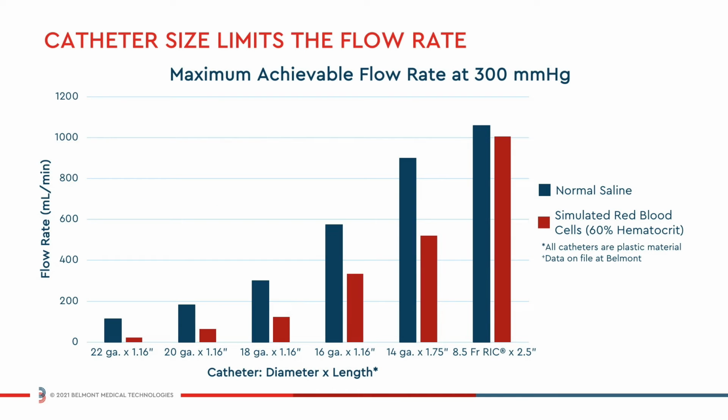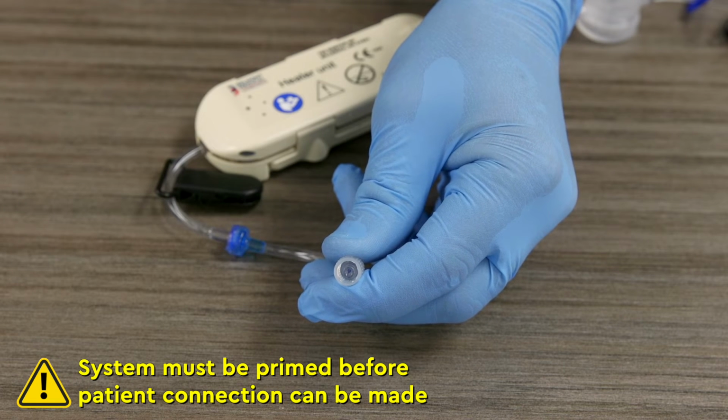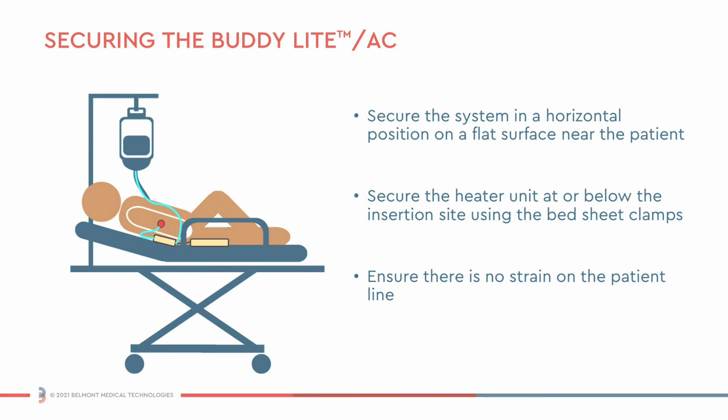To begin operation, first select the appropriate catheter size for the intended flow rate. Using aseptic technique, disconnect the red luer cap and connect the Buddy disposable to the patient's catheter. Secure the system in a horizontal position on a flat surface near the patient, and then secure the heater unit at or below the level of the insertion site using the bedsheet clamp. Check to make sure that there is no strain on the patient line.